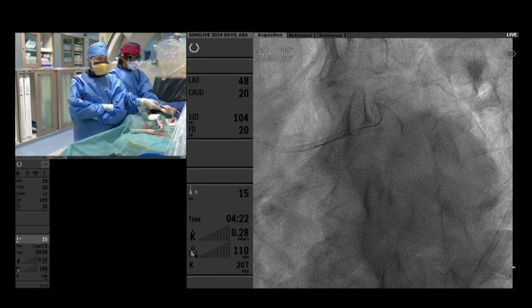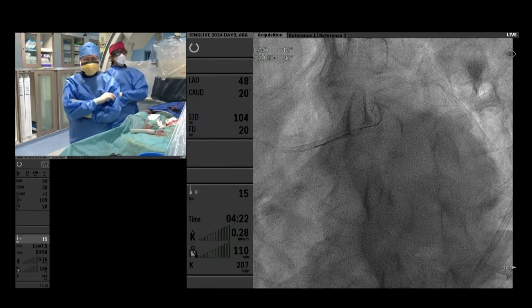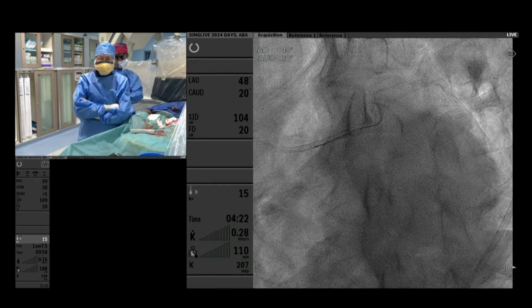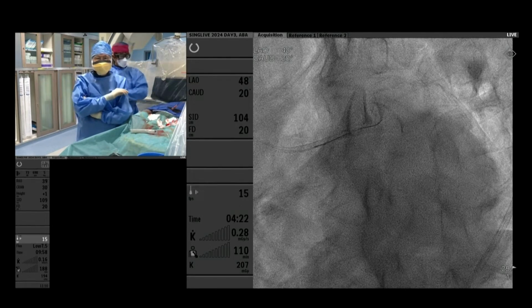Unfortunately, not all our cath labs are equipped with intravascular imaging. So we have not been able to go in for zero contrast, but we have been minimizing it with the roadmap now with the Philips. Thank you very much. I think we also face the same situation. We have one lab installed with the dynamic roadmap, but unfortunately in this biplane room, we do not have that at present. But I think we can make do. I think that's not the crucial thing for now.